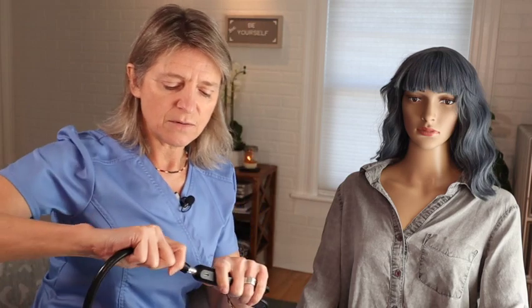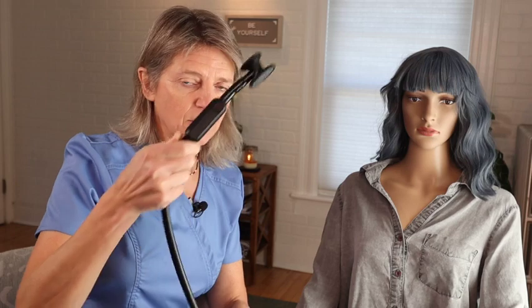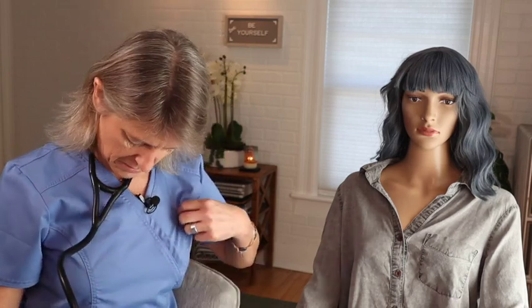I'll show you. So just know that I am not using the tubing. I do not put it in my ear. I just put it around my neck to hold it there and I can let it go. And I don't have to fumble with my pockets and all that kind of stuff. I don't have pockets up here today. I don't want to be messing around with pockets.